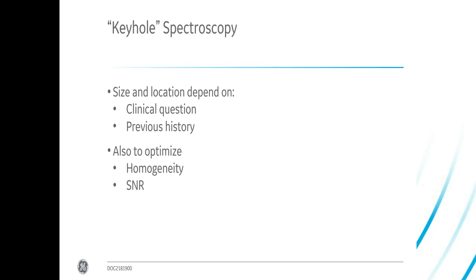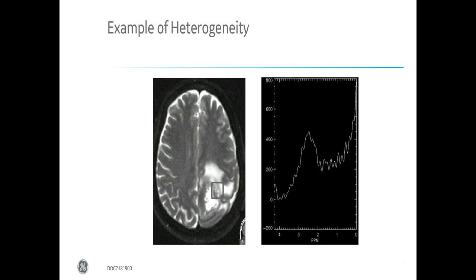So there are two things we need to focus on when we are looking at focal spectroscopy. Here's an example, a case of a highly heterogeneous region where we place the voxel. There's a lot of blood within this tumor, and so the spectrum we get, even without much knowledge, just keep in mind how a normal spectrum should look. It's far off, and therefore that's garbage.